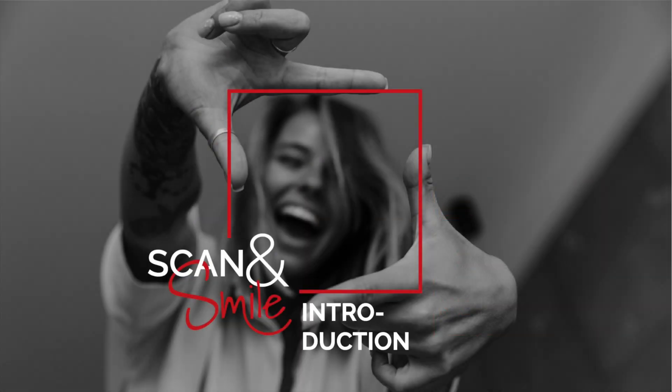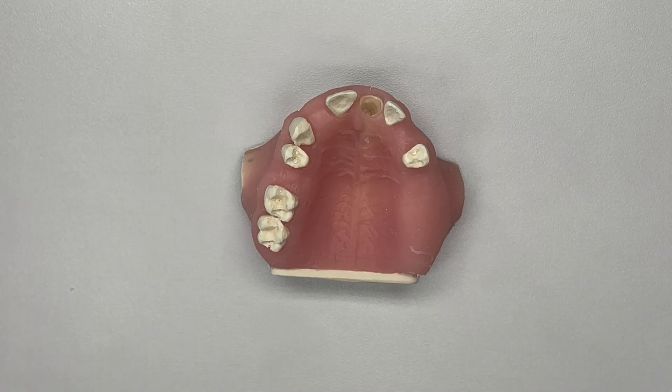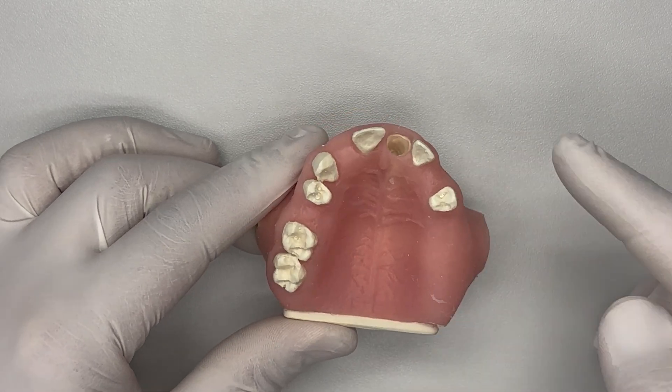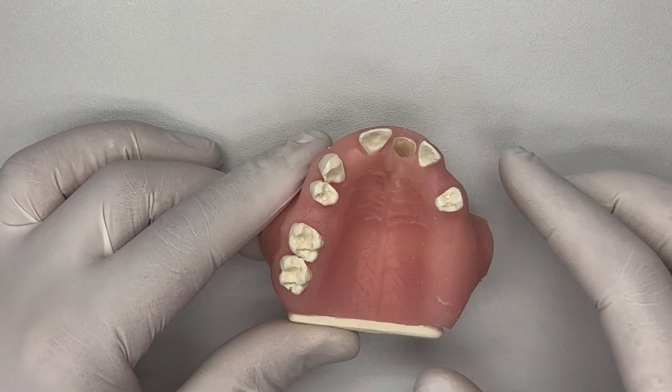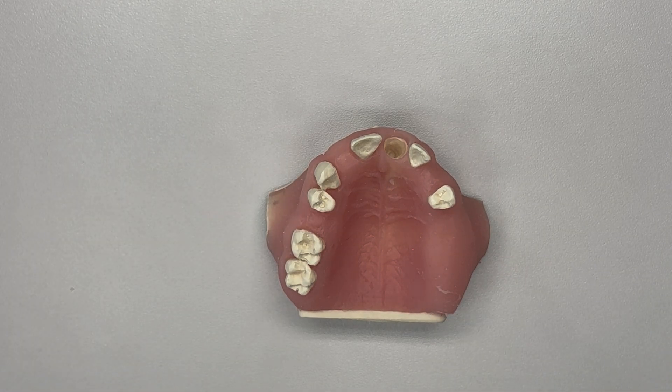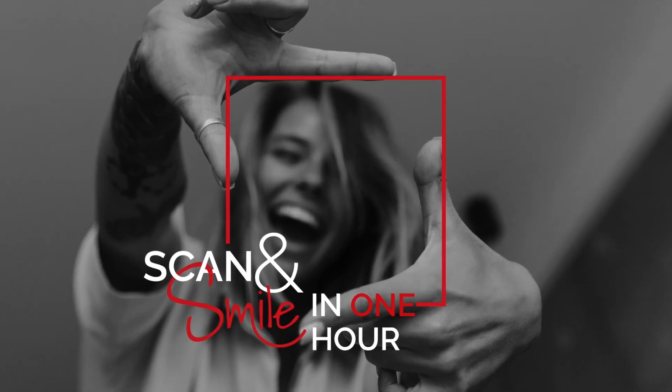Let's look at an example of the Scan and Smile solution. John, our patient today, has lost a premolar tooth and wants to leave the practice after one hour with a 3D printed aesthetic temporary crown. Scan and Smile makes it possible.